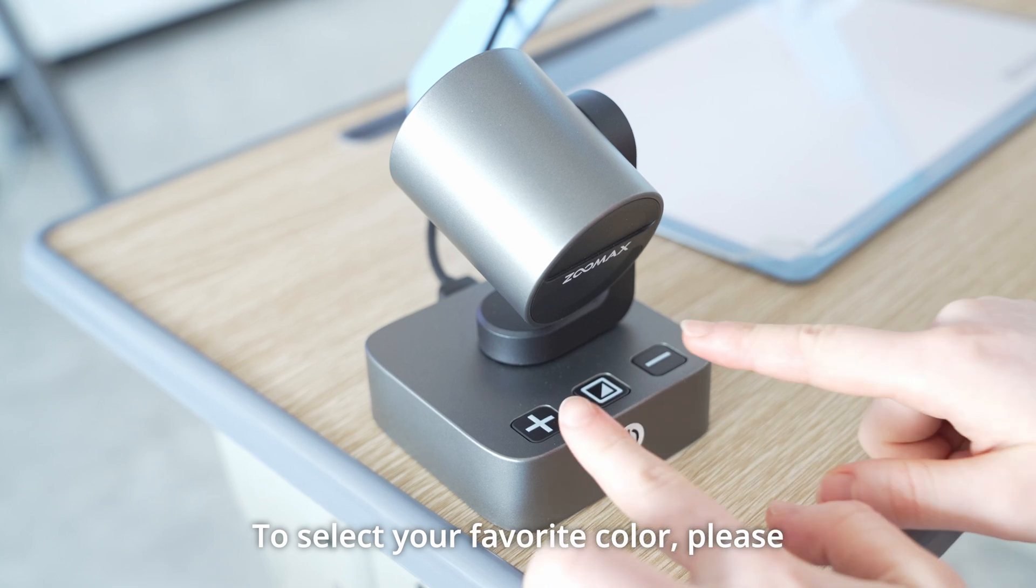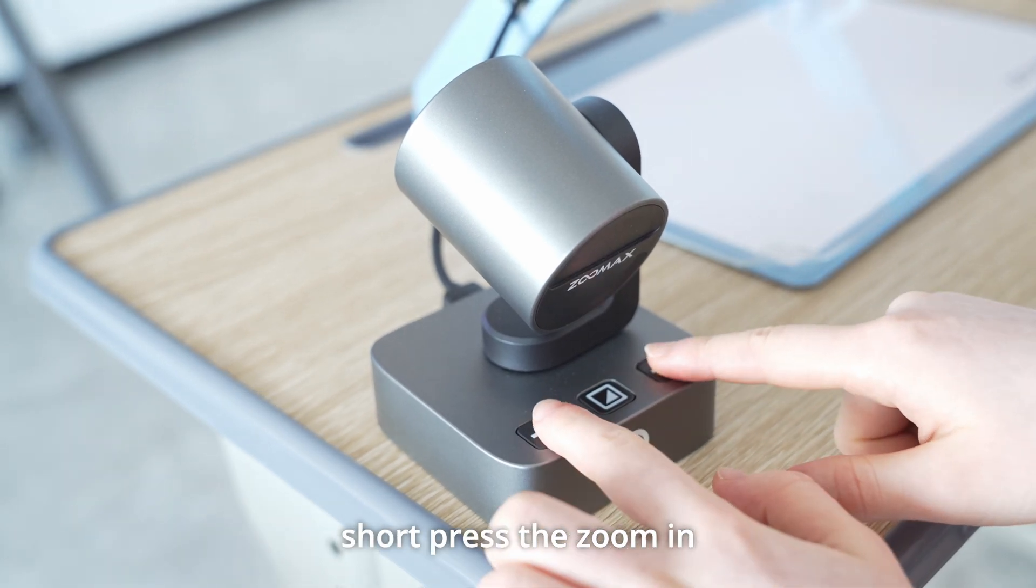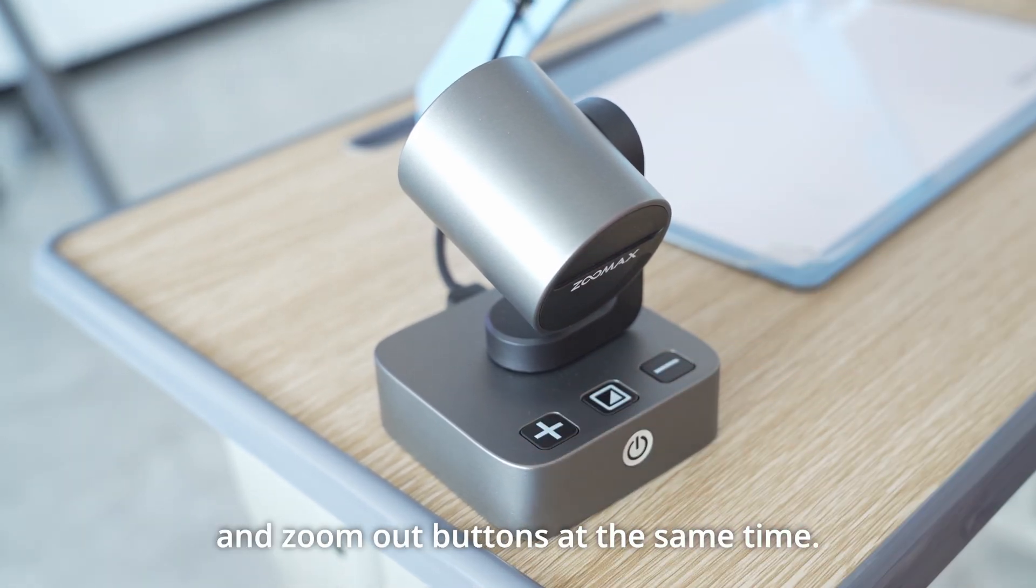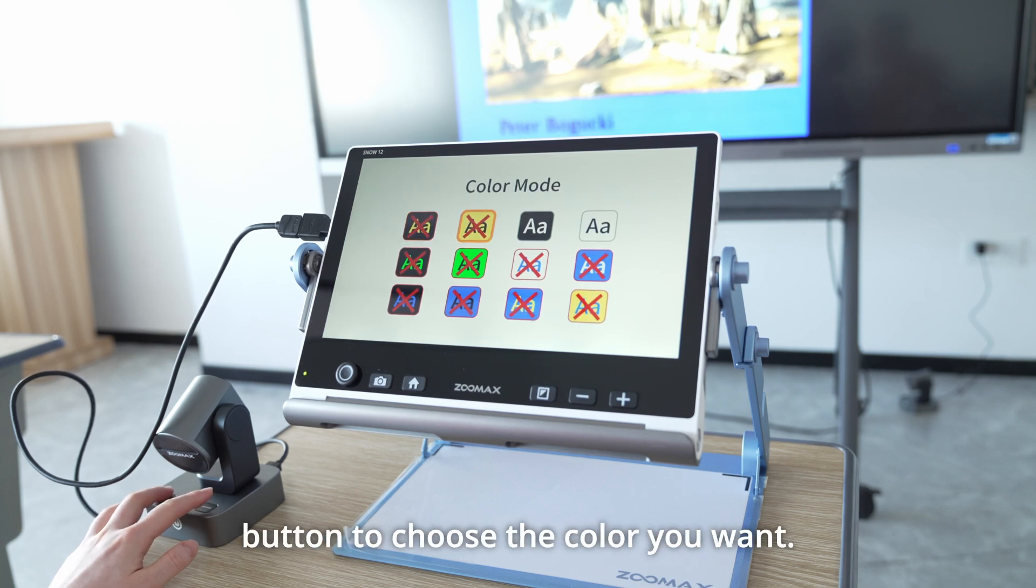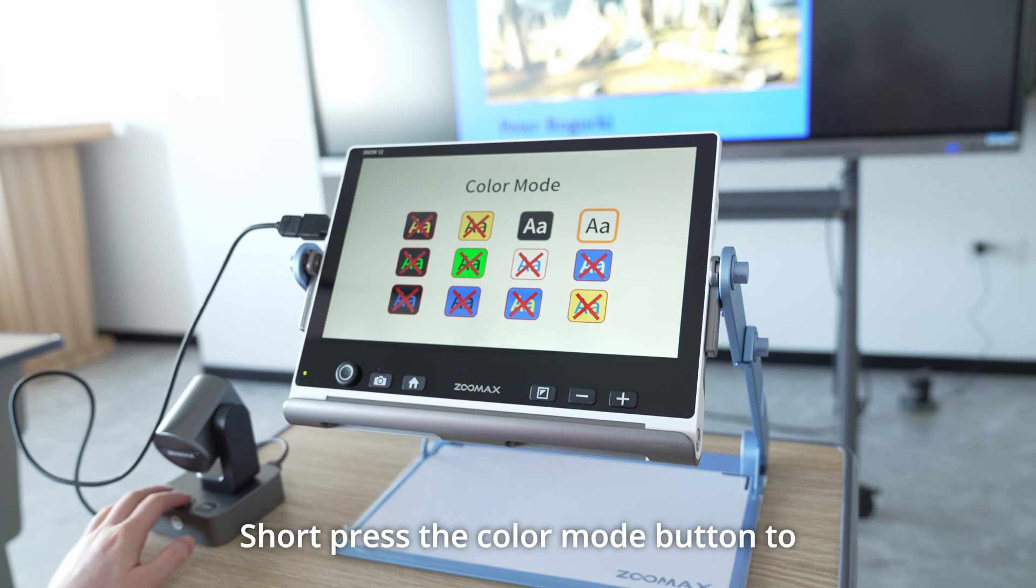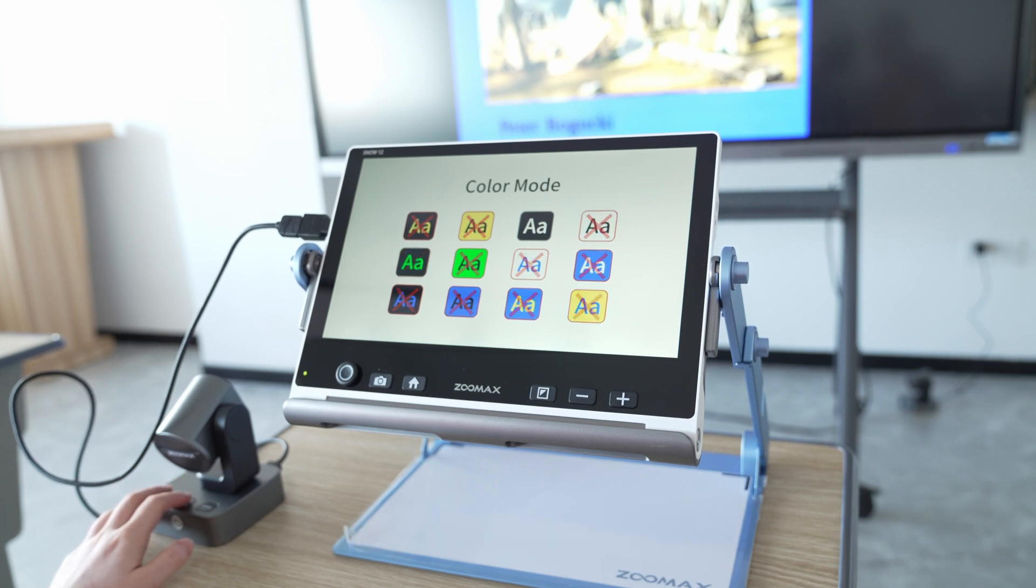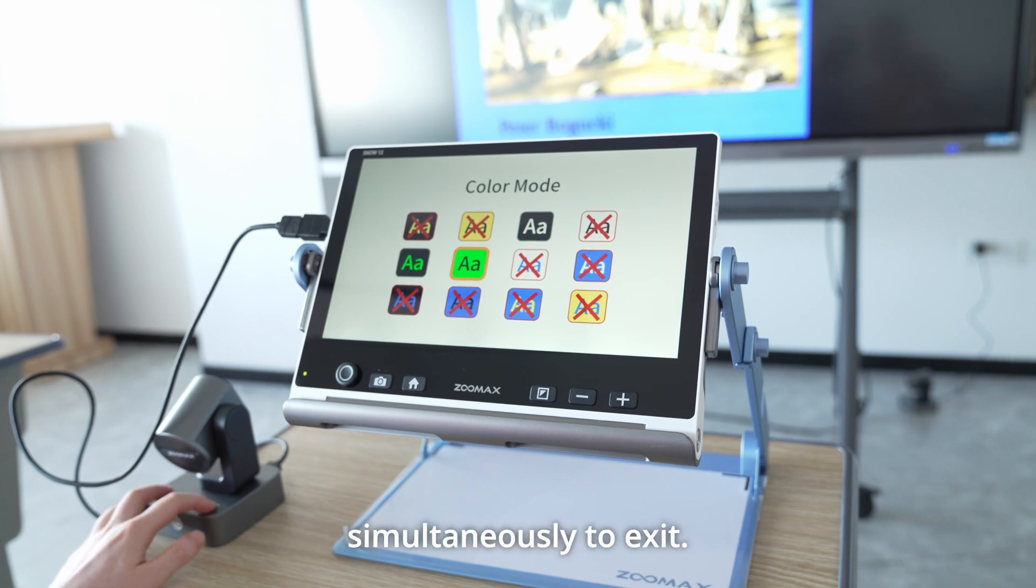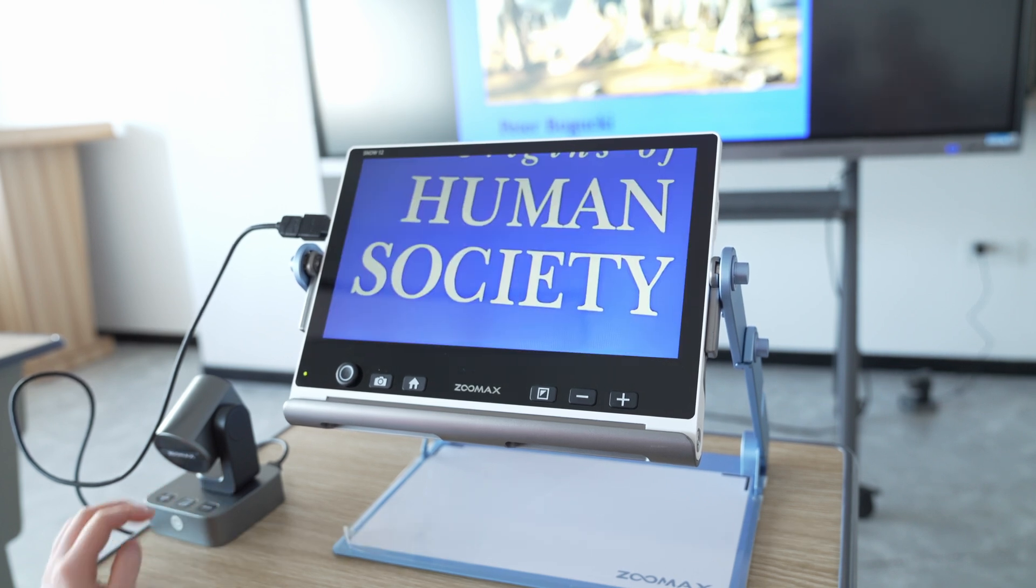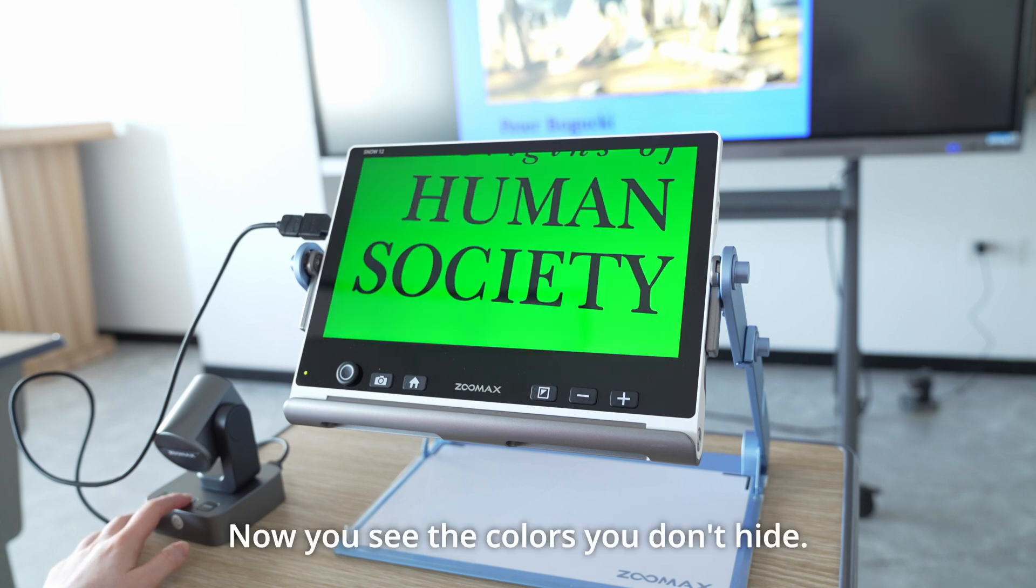To select your favorite color, please short press the zoom in and zoom out buttons at the same time. Then short press the zoom in or zoom out button to choose the color you want. Short press the color mode button to activate it or hide it. Short press the zoom in and out buttons simultaneously to exit. Now you see the colors you don't hide.